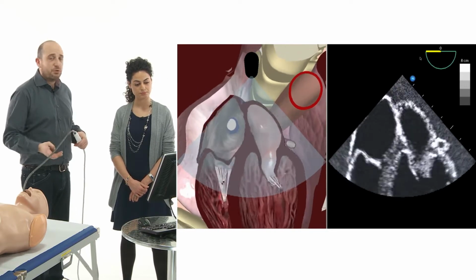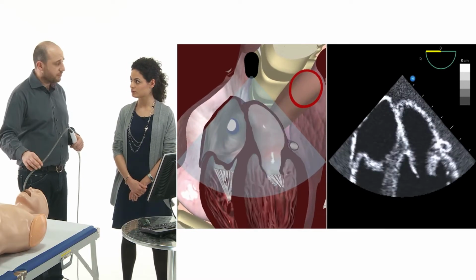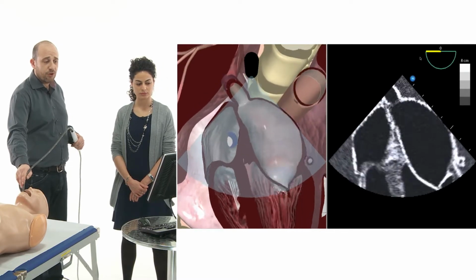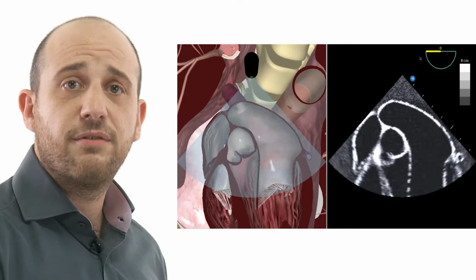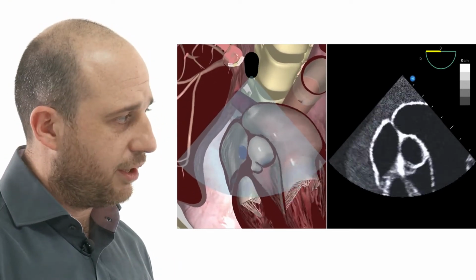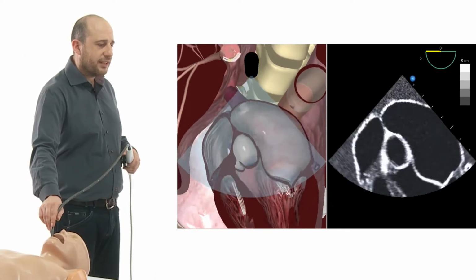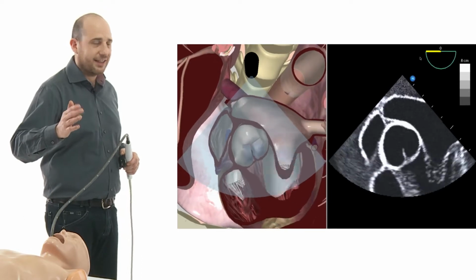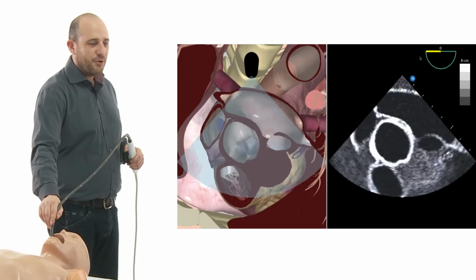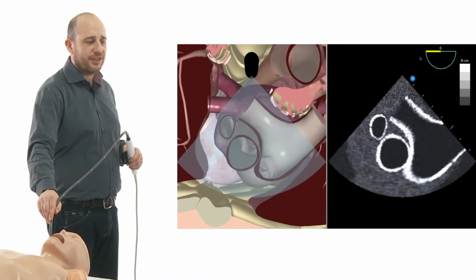So what do I do? I get the 4-chamber view and then pull the probe out a little bit till I see the 5-chamber view. The aortic valve stays in the middle of the image, and then with a little bit of anteflexion, always with A, double A, you have to pull out the probe and you will see the aorta always in the middle.